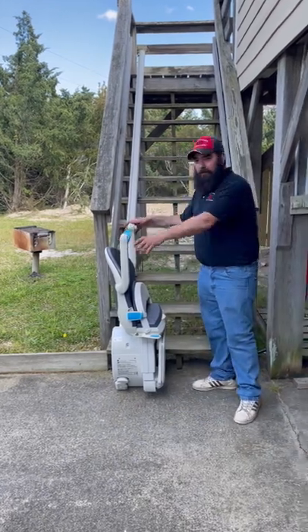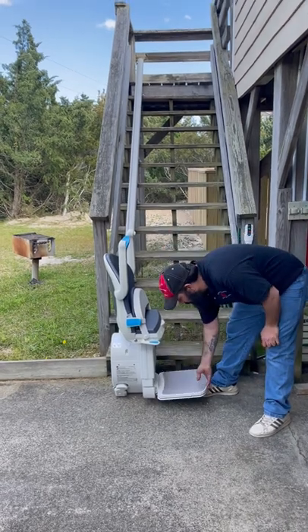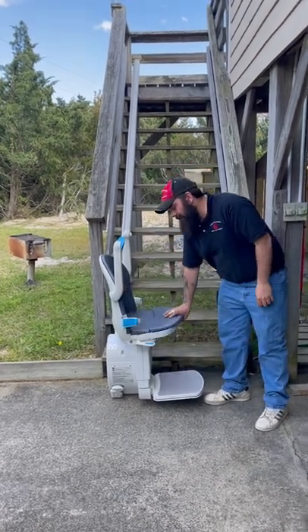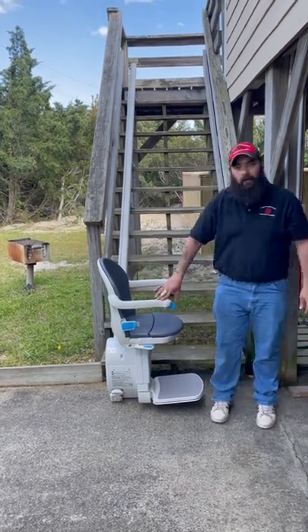Hello Kathleen, I just wanted to show you a little bit about the lift. Now to start riding, you want to put the footrest down, flip the seat down. Both armrests have to be completely down for the button to work.